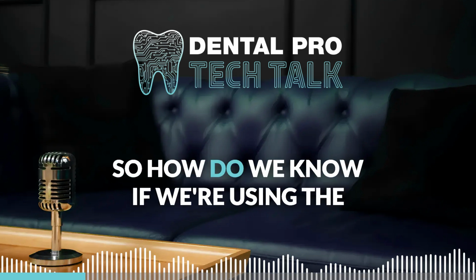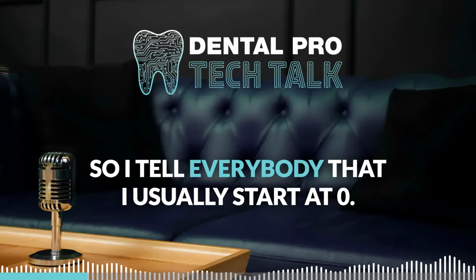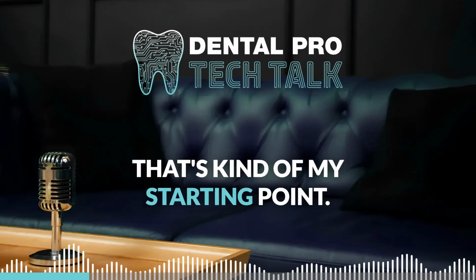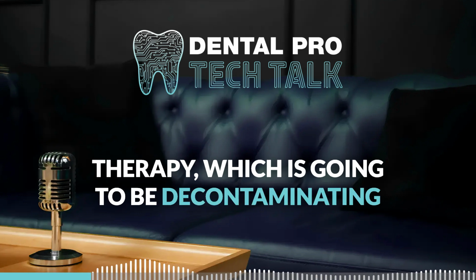So how do we know if we're using the right settings? What should we be looking for? So I tell everybody that I usually start at 0.5 watts of power. That's kind of my starting point if I'm doing laser-assisted periodontal therapy, which is going to be decontaminating a pocket.